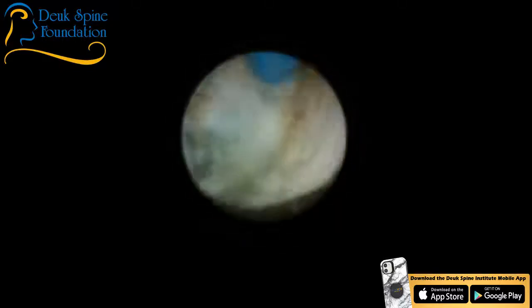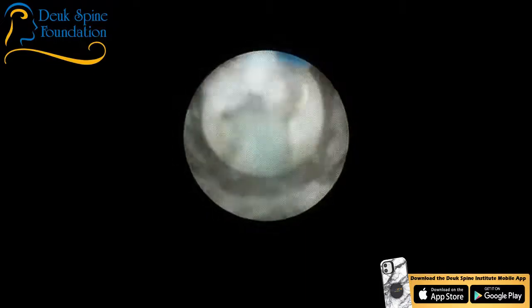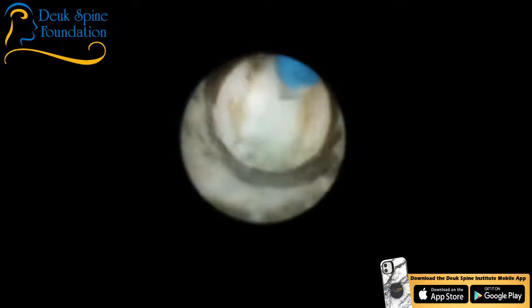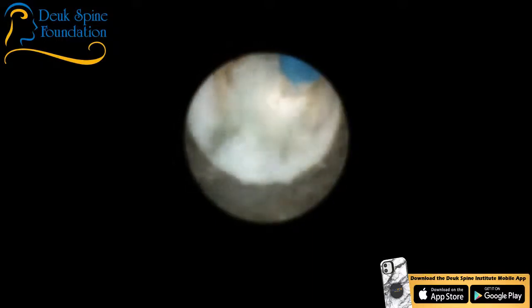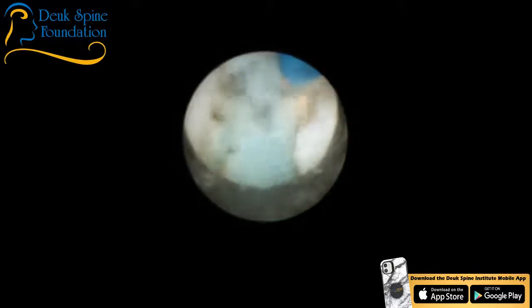It's not the whole disc that's damaged. It's just this part back here, just this little back part of the disc. The rest of the disc looks pretty good. It's not causing pain. It's not causing symptoms. Remember, we've talked about this. We don't fix anatomical abnormalities that don't cause symptoms.